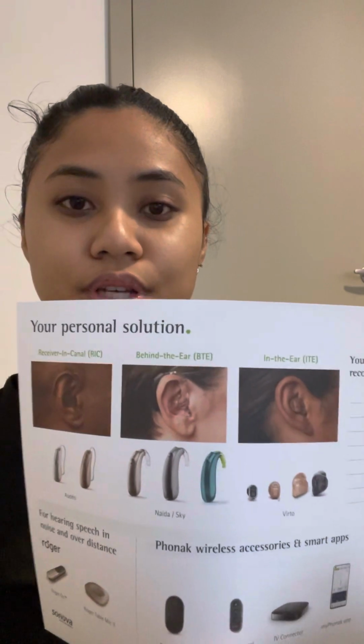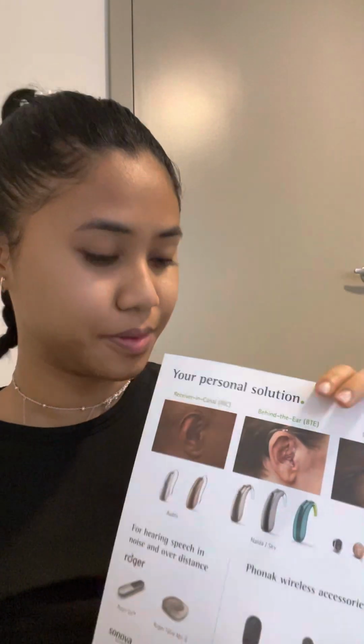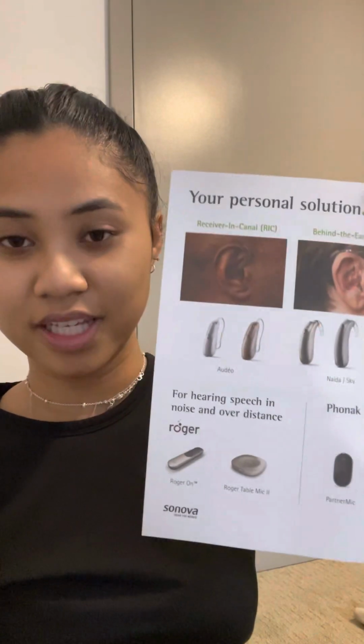If you choose to go forth, I really think that you would enjoy these hearing aids, but some quick things to note with hearing aids. When you first get them, there is a quick adjustment period. It might not be better right away. You might not think that it's better right away, but if you stick with it a little bit, you will find that it is better. You'll be able to perceive everything at a normal level.